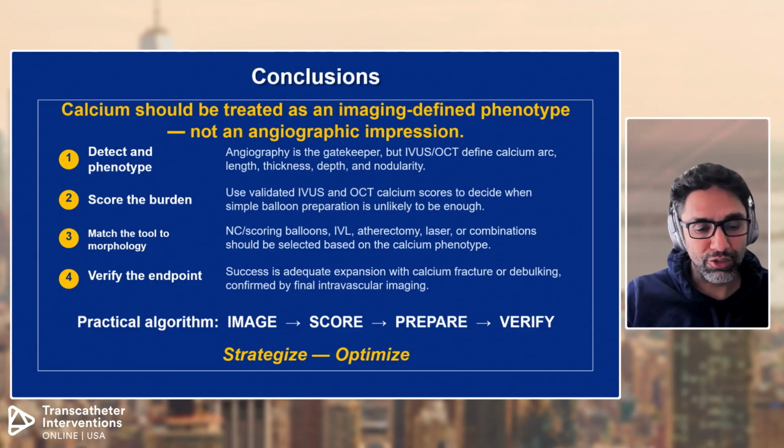Look for calcium fracture or debulking. Use adequate balloon expansion as a surrogate for expansion, and this will help us strategize and optimize to get the optimal results in these severely calcified patients. Thank you so much.